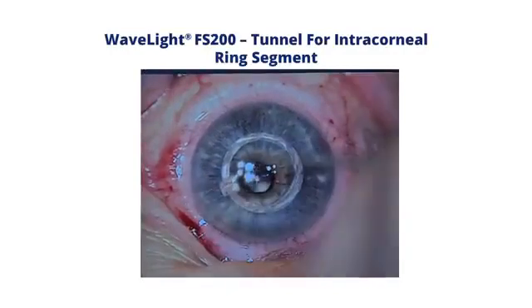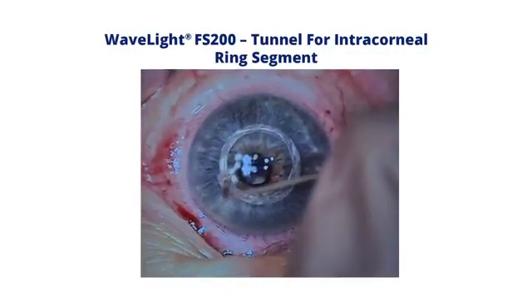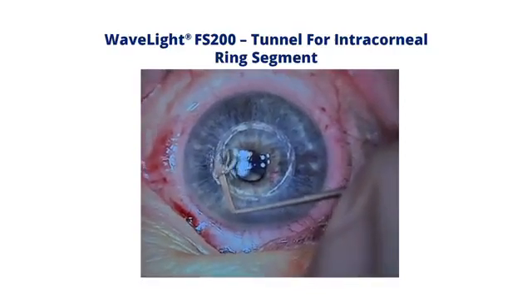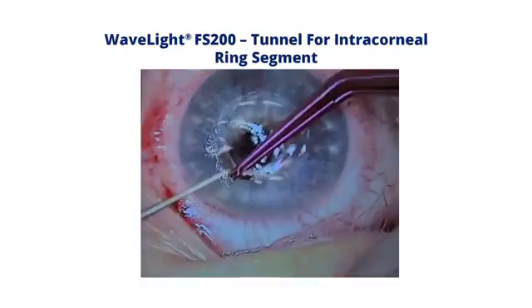Let's have a look at the surgical procedure of inserting this ring. So we've got the plan next to us, which we keep inverted because we're looking at the patient from the top. We put a spatula in to open the ring tunnel, so we've got an entry. We lift up the ring and insert it gently.